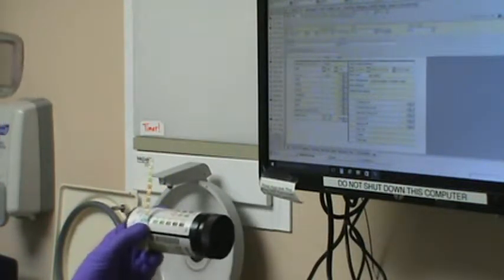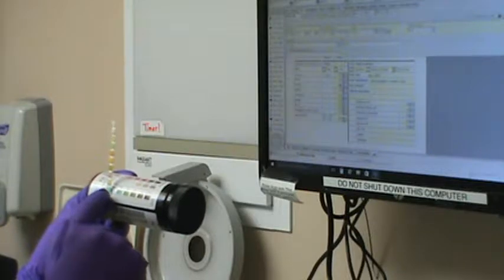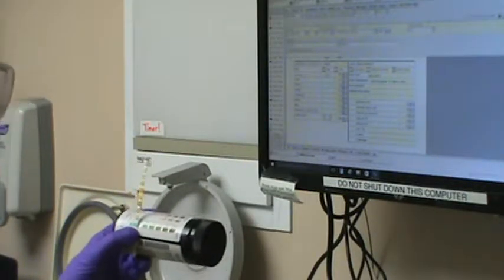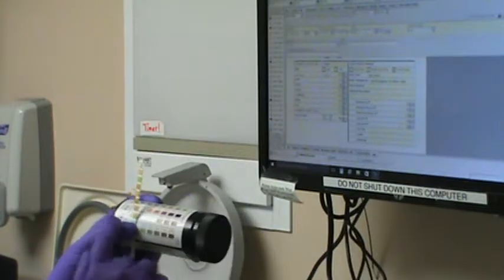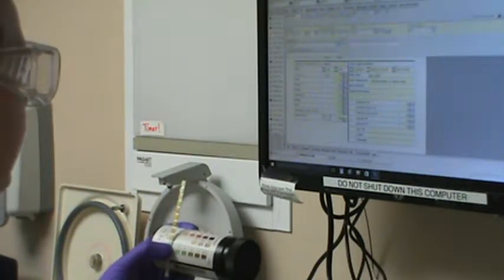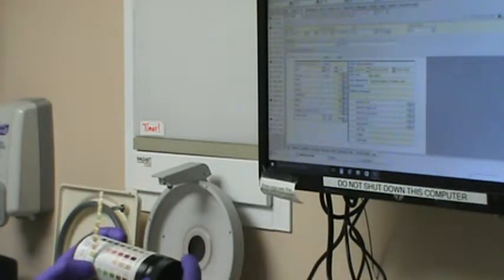We're going to find where our glucose is, which is right here, and for our glucose, we are negative. So I'm going to leave it at 0 because we are negative. Next, you have the bilirubin, which in comparison to all of the other colors on here, is negative. So for our bilirubin, we're just going to leave it at 0 because it's negative.